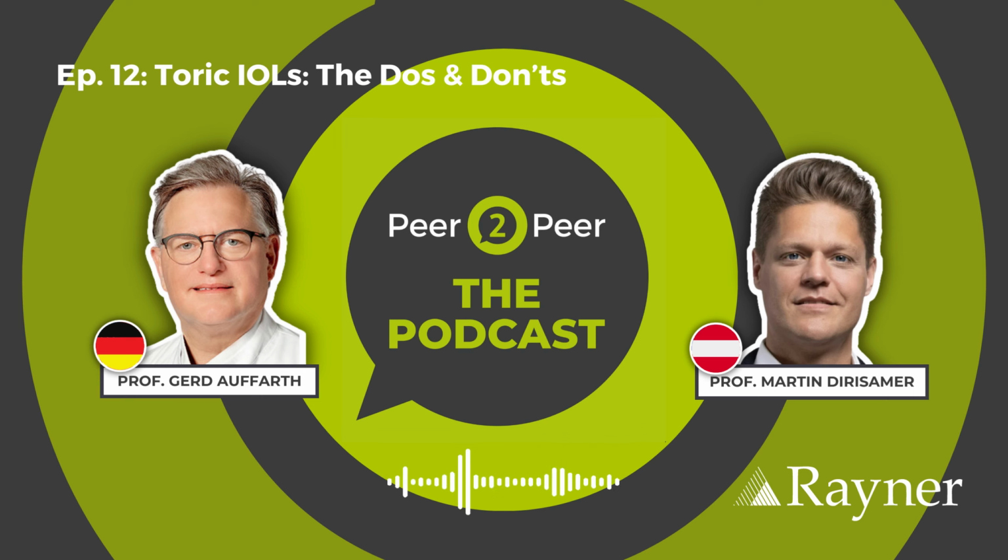Yeah, I can really relate to that. If we think about the success of the toric lenses, it started with the ink marking. For more than 10 years, we only had that. I remember the first multifocal toric lens. It was a Rayner lens implanted by me in 2006. It was just made with 2 ink marks, and it was a success. So I think it's not bad.